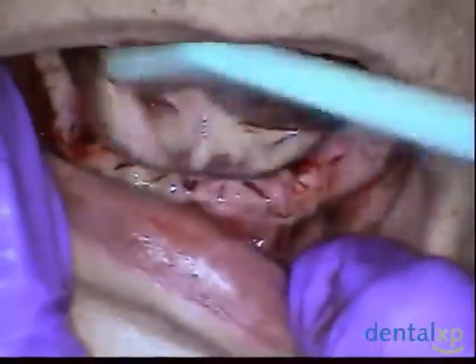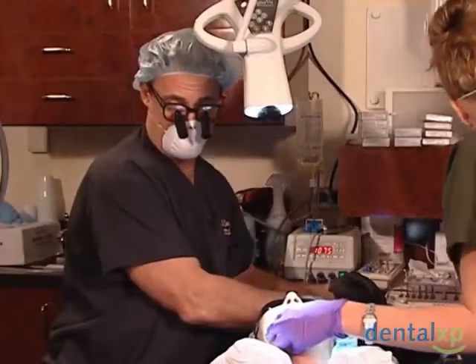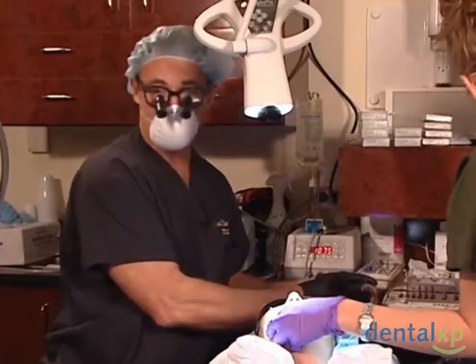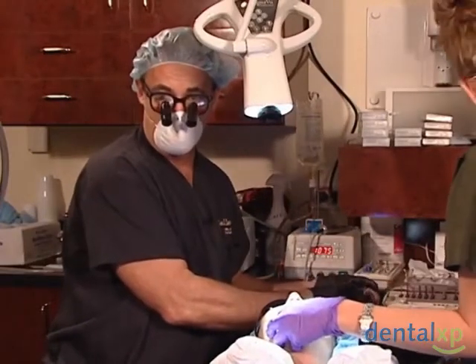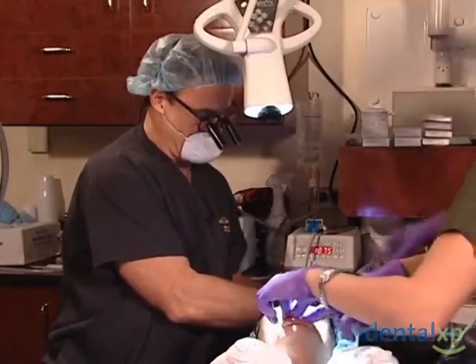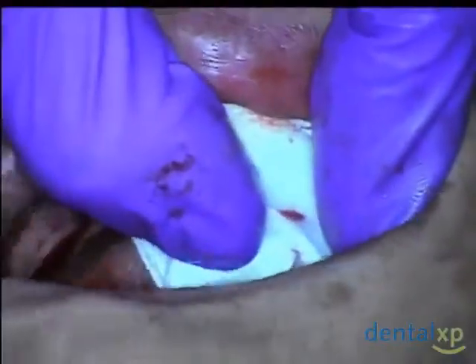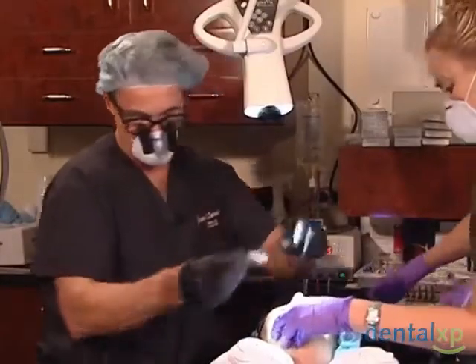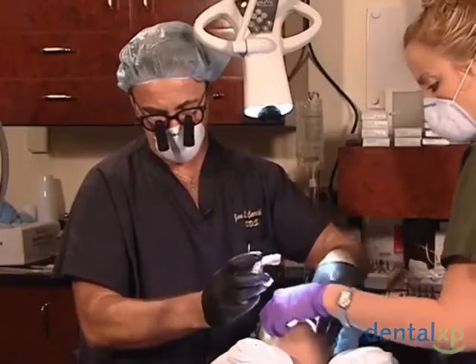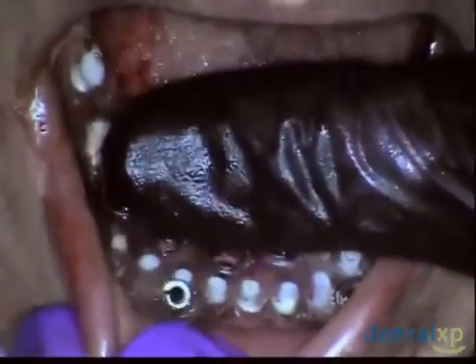Which is another point. If I have an area where I could put, say, a 4.0 or a 5.0 implant, but in order to do that, I'm going to have to take a centimeter of bone away because at the occlusal interface, it's too narrow. In my mind, it makes more sense to save the bone and place a smaller diameter implant that is sufficiently long rather than place a wider implant and have to reduce the amount of bone necessary for the implant to be in between the buccal and lingual plate. Go ahead, our insertion pins again.